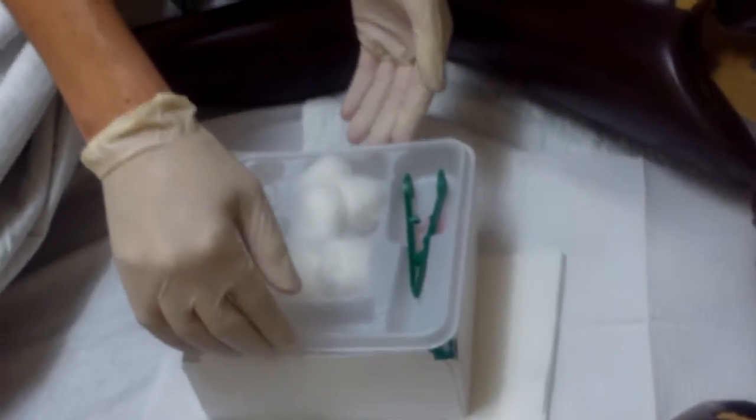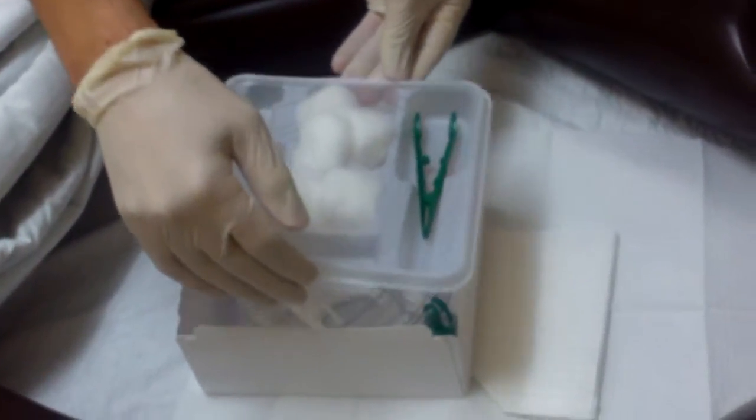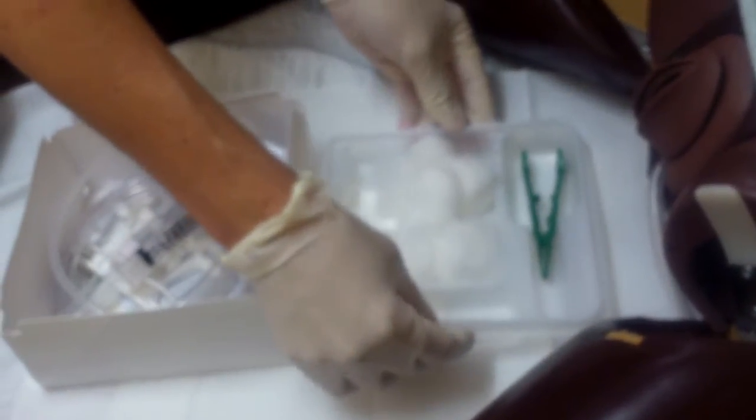I'm a rusher. Noting the 1 inch edge. Not like purposely doing this. Okay. Take this, put that right there. So then everything is in my sterile field. I'm going to move my table a little bit so I can better work once I get it in.